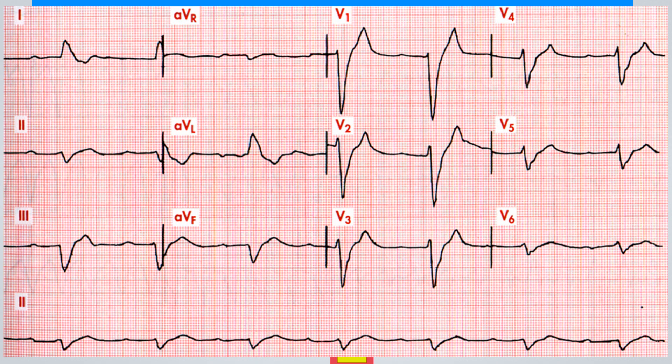Take a look at this ECG displayed on the screen. We can clearly observe a significant widening of the PR interval accompanied by a sinus rhythm. Additionally, there is an extremely widened QRS complex that does not correspond to any specific conduction disturbance, such as left or right bundle branch block. This widened QRS complex is also associated with a sharply peaked T wave. These findings suggest a potential case of severe hyperkalemia.